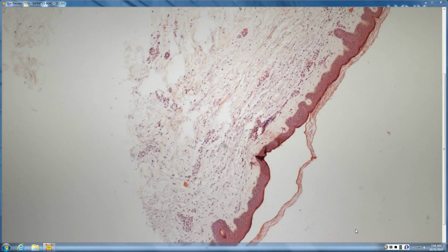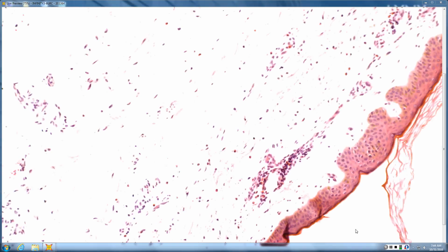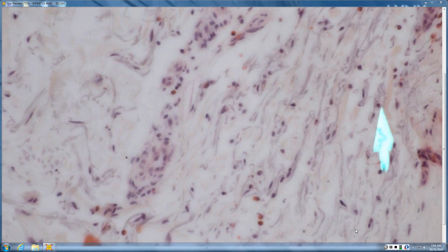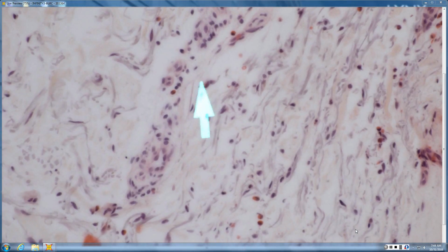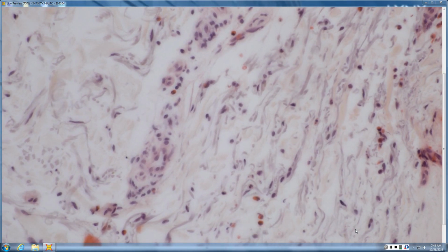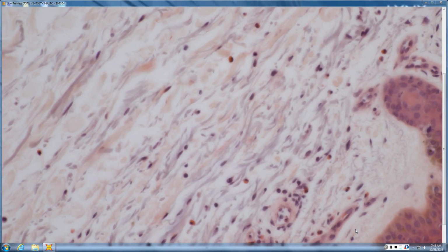Dr. David Perry. Let's see. So we have a little punch biopsy. Kind of sparse infiltrate. It's a little bit interstitial as well. So it's a sparse infiltrate, superficial and interstitial. When we look at that infiltrate, it's lymphoid predominantly, some eosinophils. And I see a fair number of neutrophils. Fair number of eosinophils. I see some neutrophils. When we look at the vessels, there are definitely some neutrophils in the lumen. So you have like a urticarial process. It doesn't look like there's vasculitis per se.